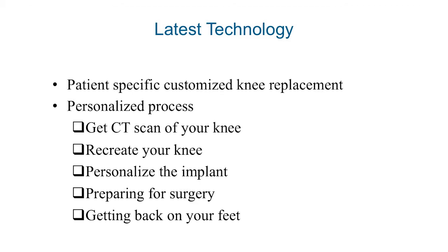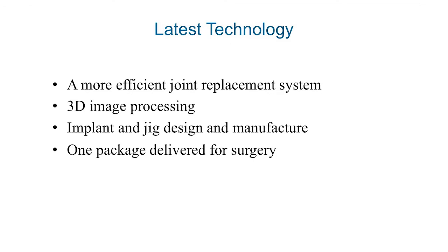So there are various steps involved, and the main step that involves the patient is having a CT scan. The CT scan is done here at the hospital with a special protocol, and all those images get sent to the company in Massachusetts, and then they have some computer whiz kids who work out the shape of the prosthesis, and then it's all made with 3D mapping and 3D printing the various cutting blocks. And the production process takes about 6 weeks.